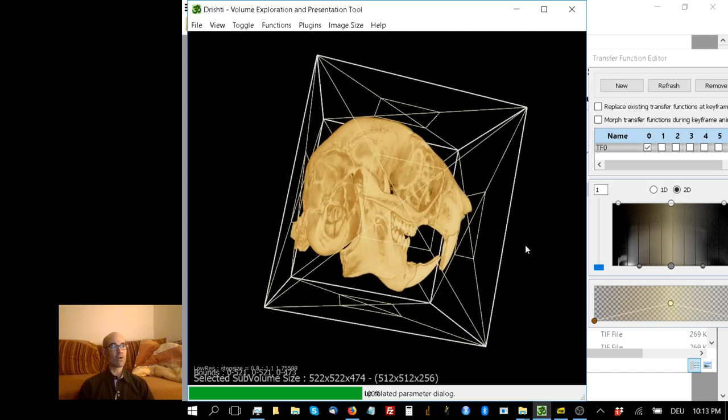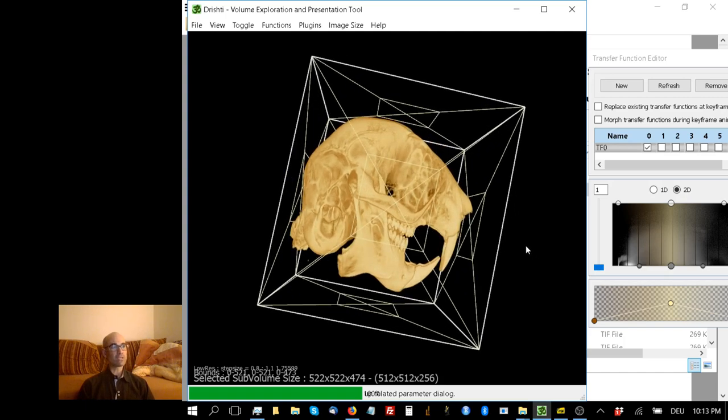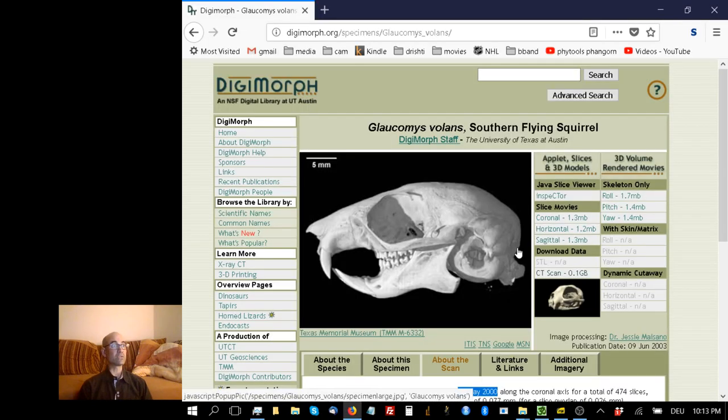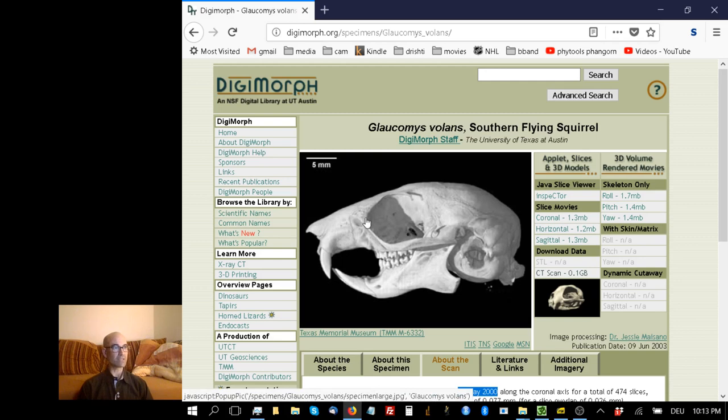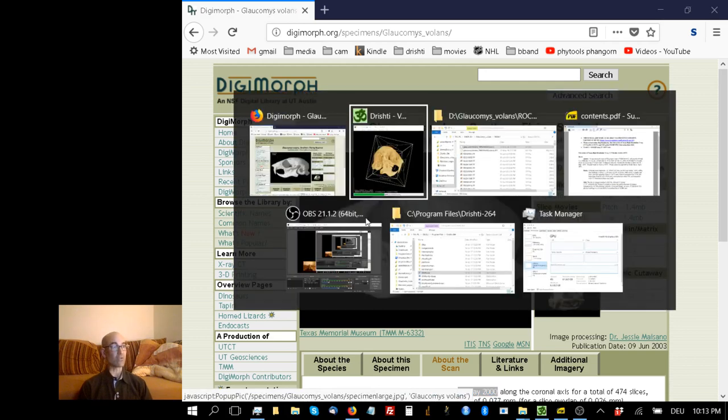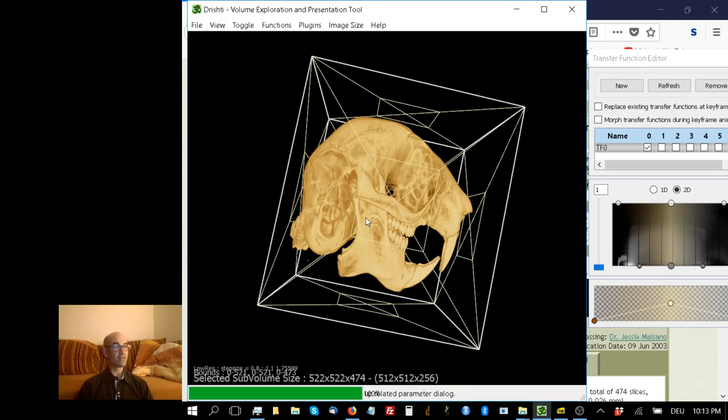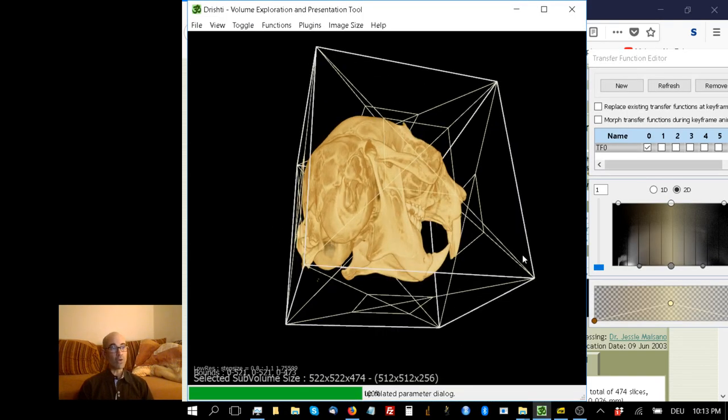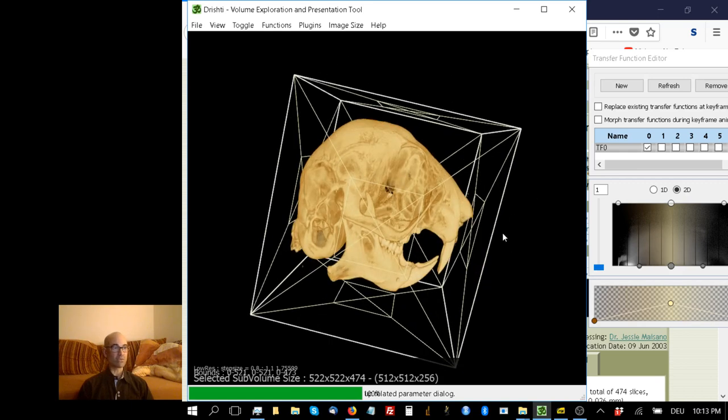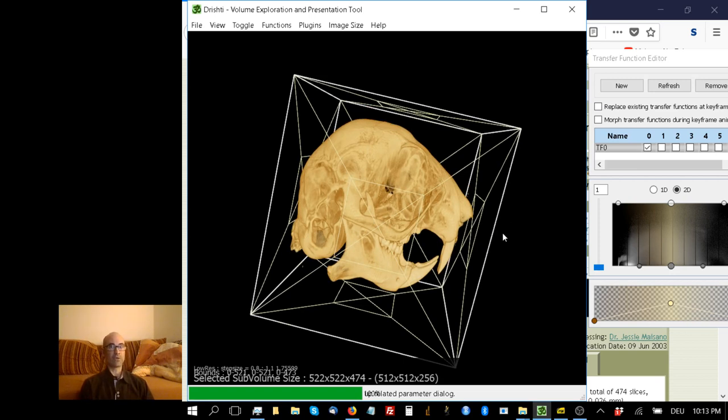Now, you may be saying to yourself, that looks a little squished, doesn't it? If we go back to the Digimorph site, clearly there's something wrong here. This skull does not look like this skull. All this amounts to is the fact that in the low-res mode of Drishti, it only renders files isometrically. So X, Y, and Z are assumed to be identical.